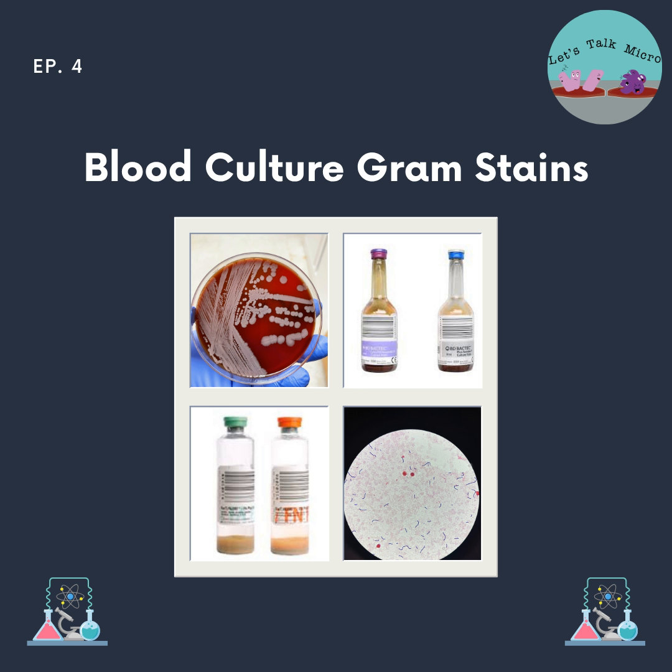If you're doing bacteria, it's 5 days, meaning that if there is no growth or the bottle stays negative for 5 days, then the result goes out as no growth 5 days. If you have fungi, you incubate them for 28 days. And for mycobacteria, 42 days.